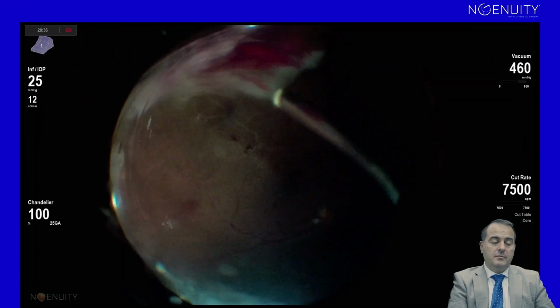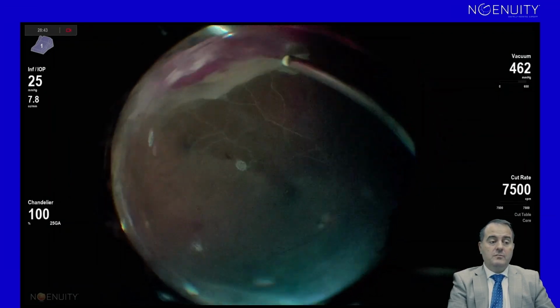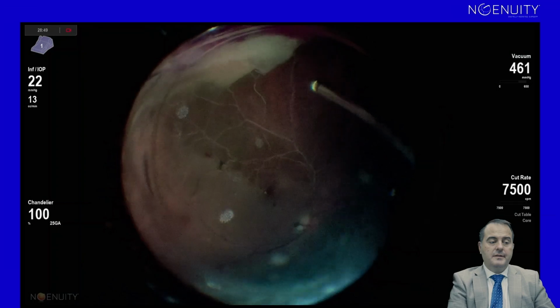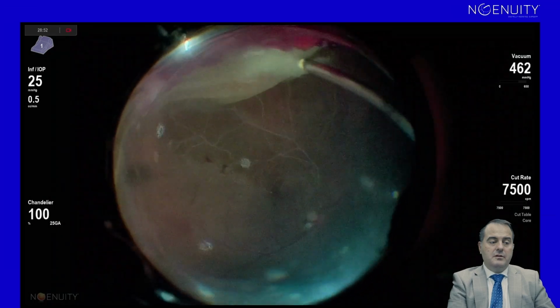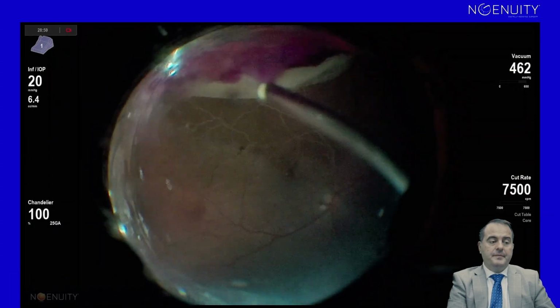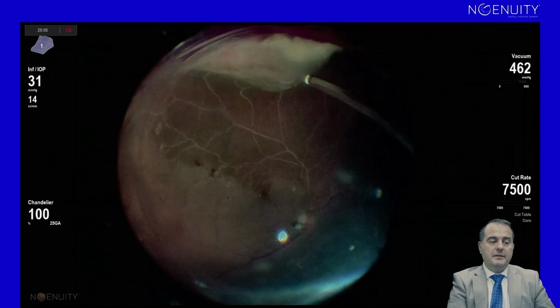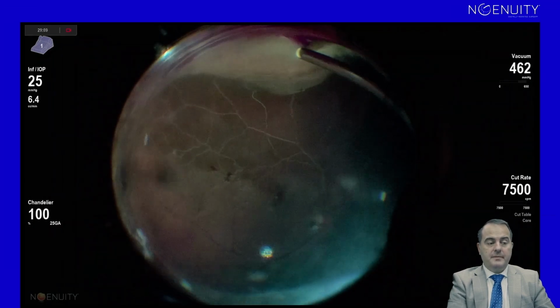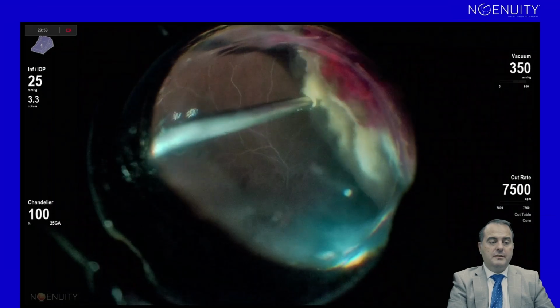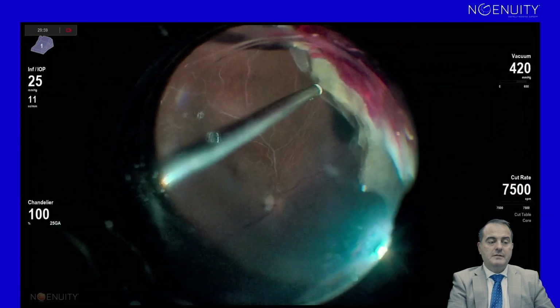Here this is a case of branch arterial occlusion of the retina, and it was a hemophthalmos case, so you can appreciate the cleaning and the details that you might see here. Now after a moment you will see the opposite side of this fundus, and just the details are increased, so we can see better and we can work safer, I must say. You see the old hemophthalmos, the new blood collection here. Again, this is far periphery, so it's near to the ora serrata.